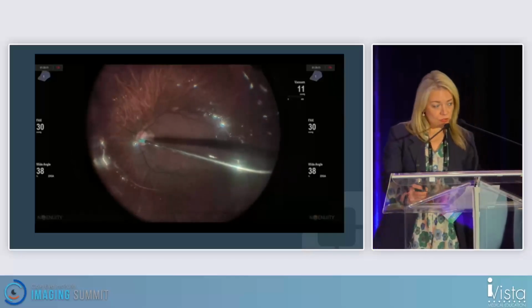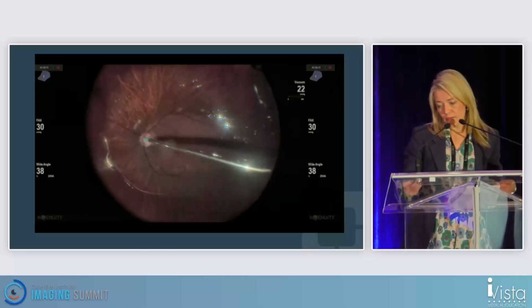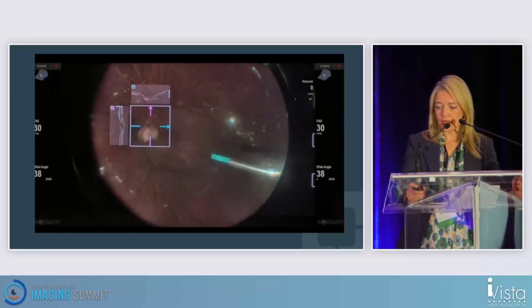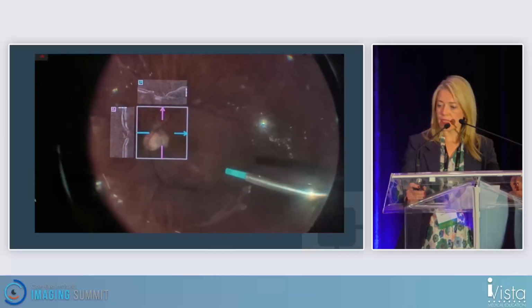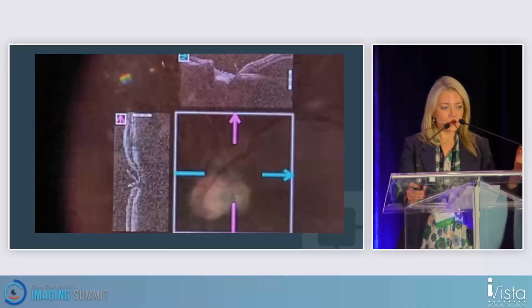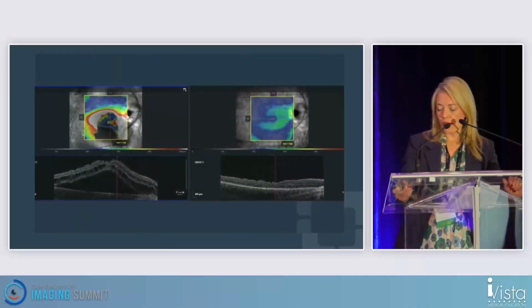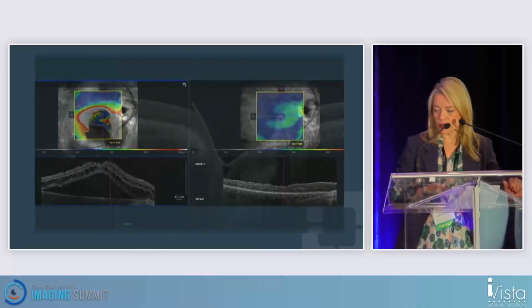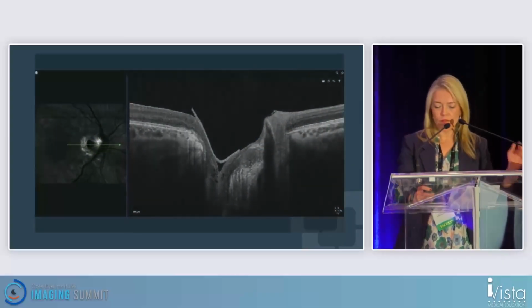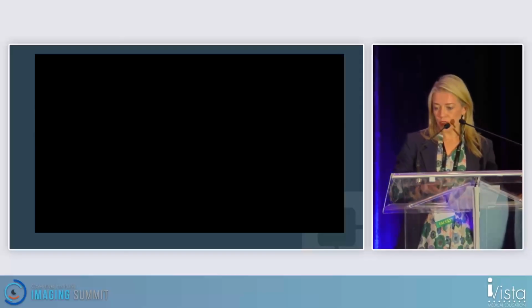And you can do intraoperative imaging. This is a phakic patient, and you can image intraoperatively under air, and I have a nice fill, and I feel very, very comfortable here that my job is done. I don't need to now poke more and potentially cause some damage. And this patient did really well. I've been following him now for several years, and there's no recurrence.